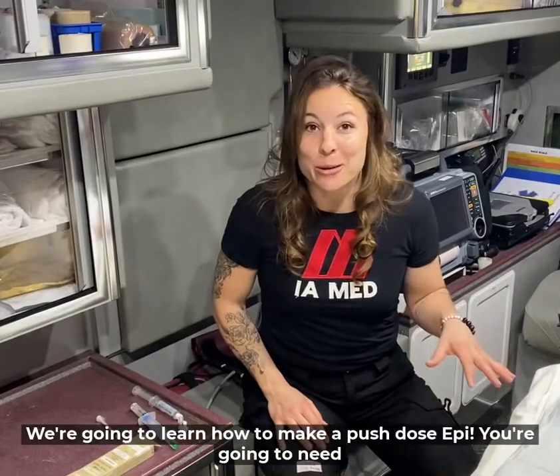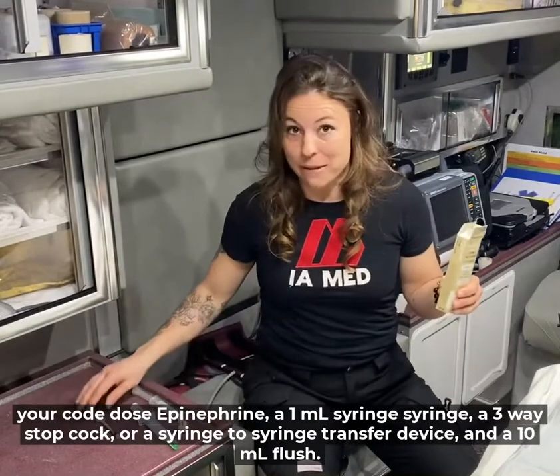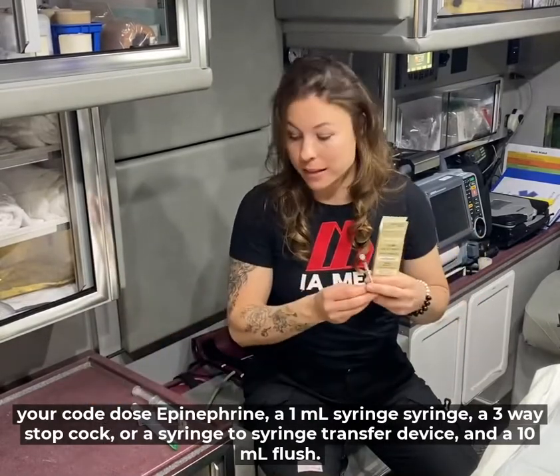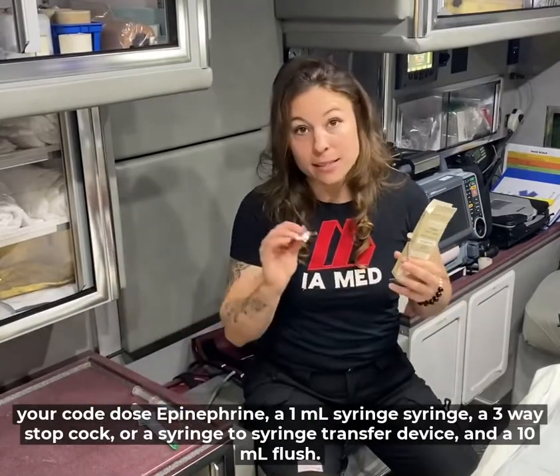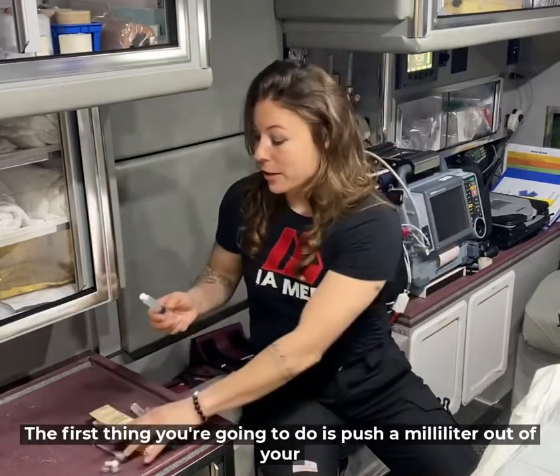Today we're going to learn how to make a push dose epi. You're going to need your code dose epinephrine, a one milliliter syringe, a three-way stopcock or a syringe-to-syringe transfer device, and a 10 mil flush.